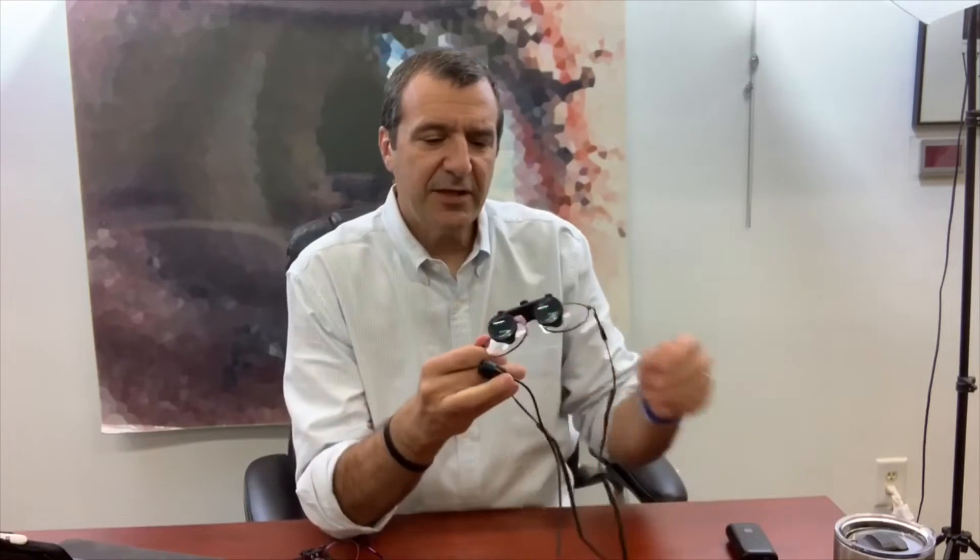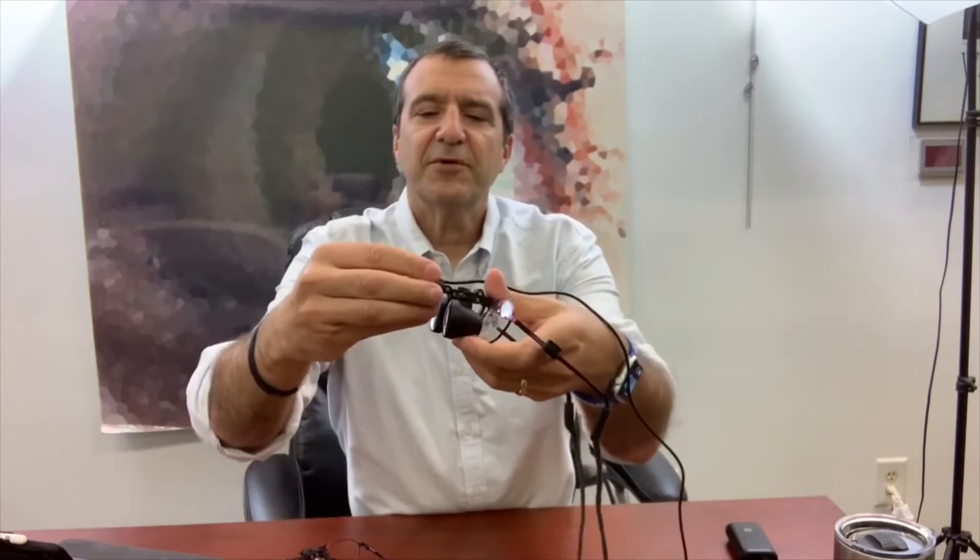The light attaches right between your eyes. The way this works is it snaps on right between your eyes — between the telescopes and the magnifying telescopes — and then we press it into this little clip here to keep it out of the way.